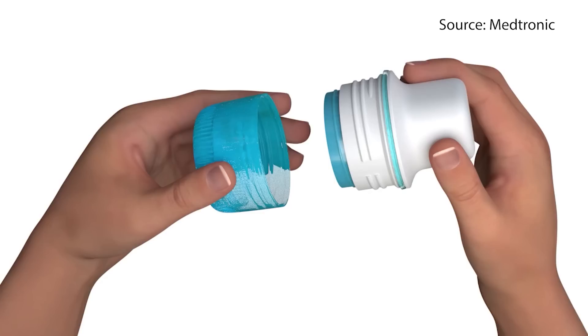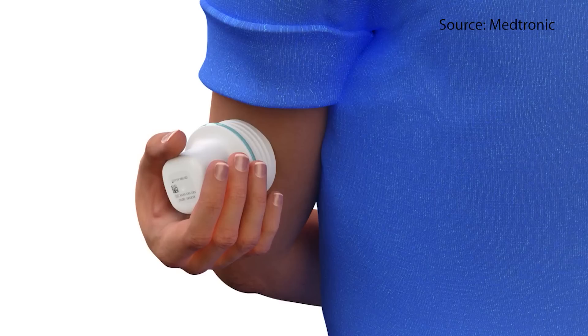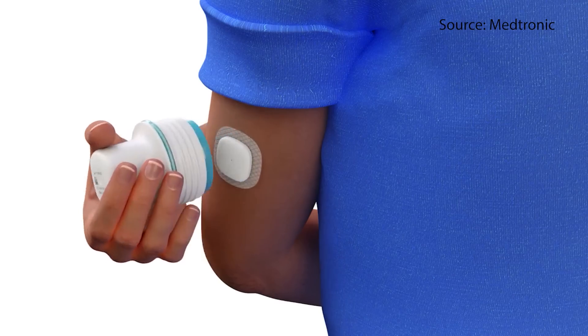Simplera only has a seven-day wear time, which is not very long, especially compared to CGMs that are now up to 15 days. But if you have health insurance and receive these through it, you don't have anything to worry about when it comes to sensors falling off. You'll get one every seven days, put a new one on, and since you can overlap them, there's really no warm-up gap — though you do need to think ahead every seven days.